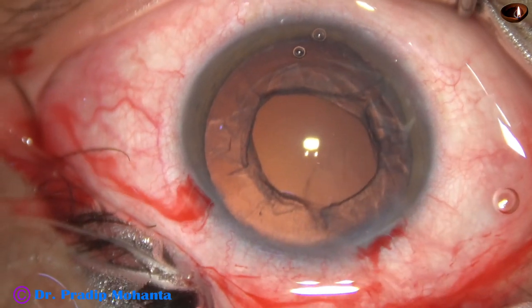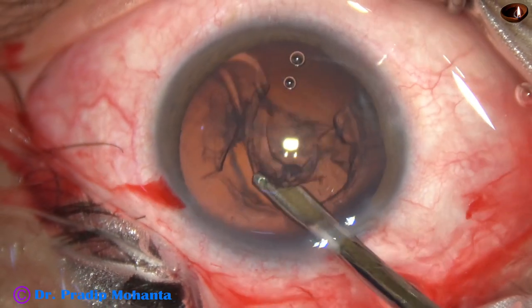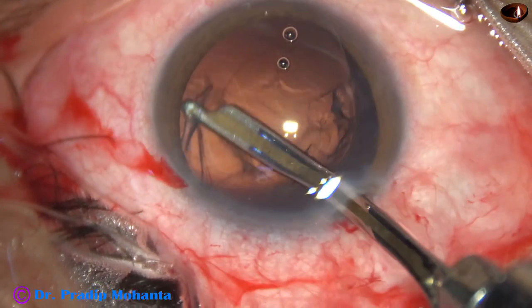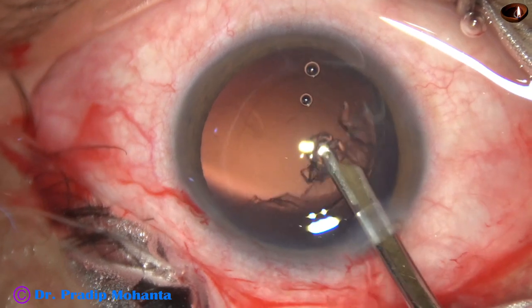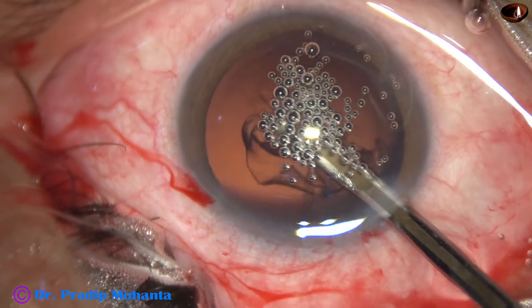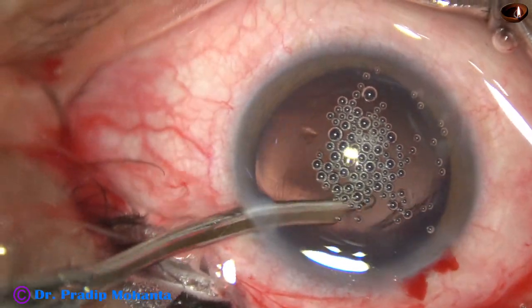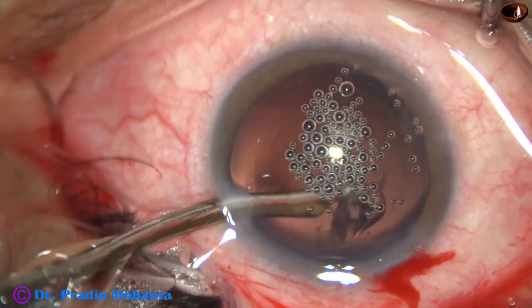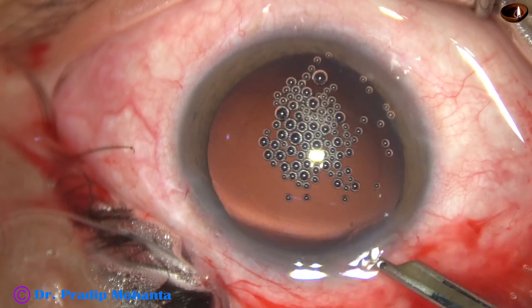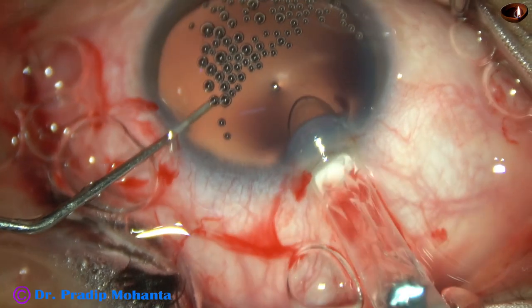HPMC is injected again. Now the cortical lens matter is being aspirated by a 23-gauge Simcoe cannula. To maintain the anterior chamber depth, HPMC is injected prior to use of the Simcoe cannula. Going through the side port, I remove the cortex from 12 o'clock and 11 o'clock. The subincisional cortex comes out easily. There is only one side port, with a width of about 1.8 millimeters.